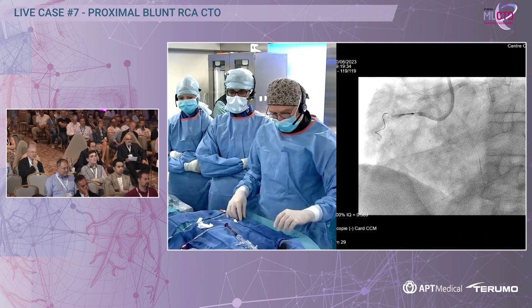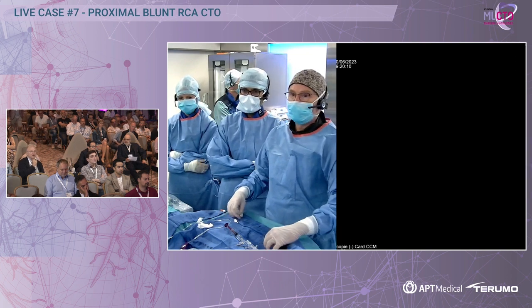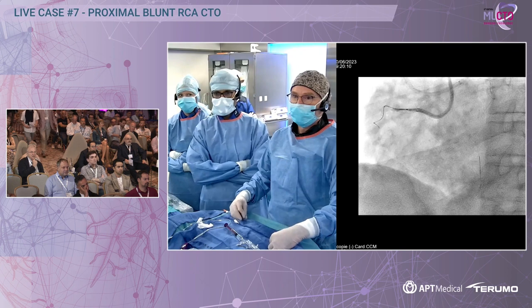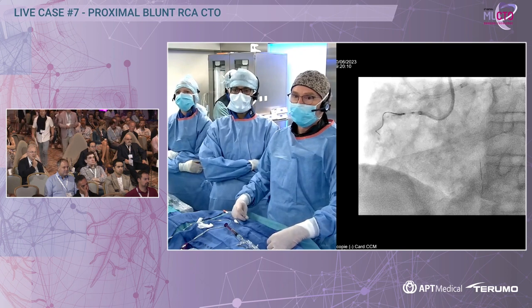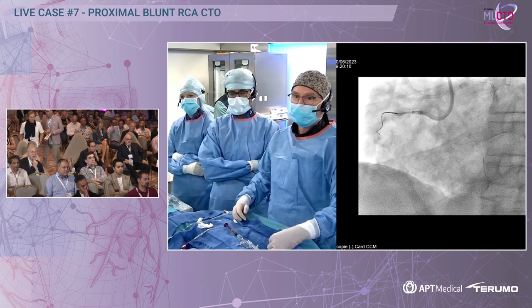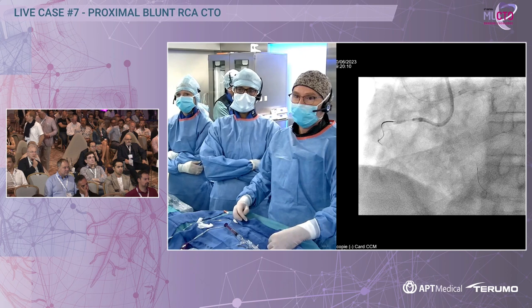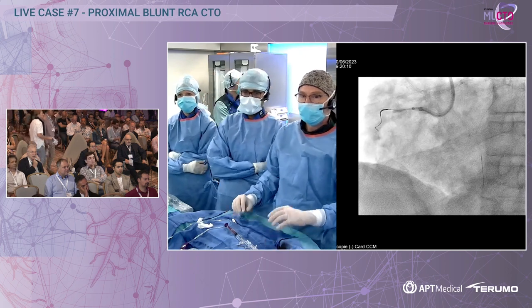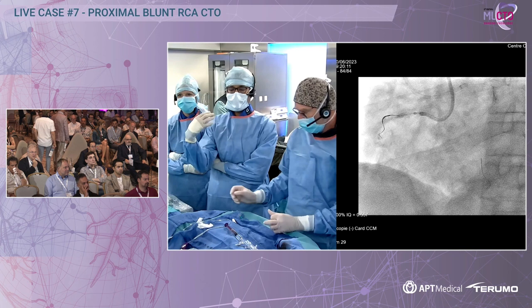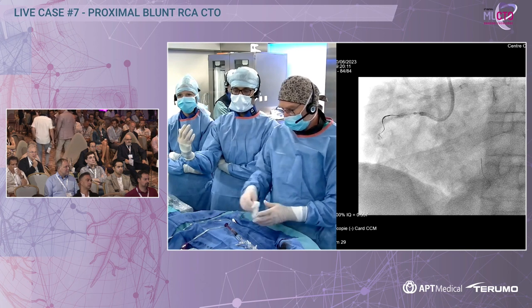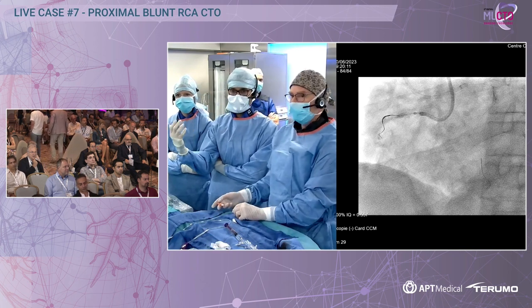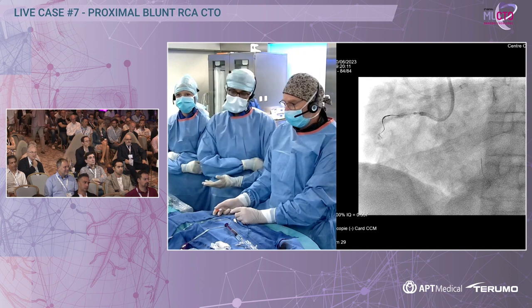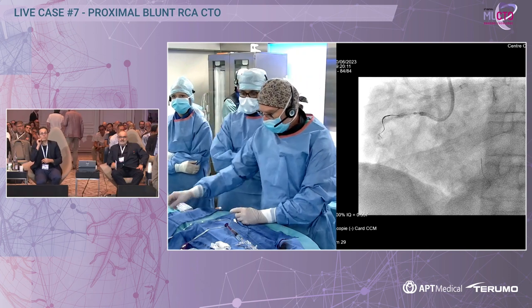One of the things we are looking for — I don't know if you can see — there is some staining as the wire was exiting, so it pretty much tracked. Another thing, stating the obvious: Alex is super experienced, but it's always a good idea to get an orthogonal projection to make sure you're still tracking in the RCA, for those starting off or even for more experienced operators.